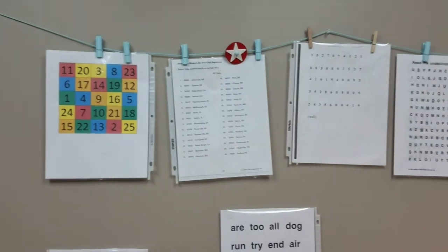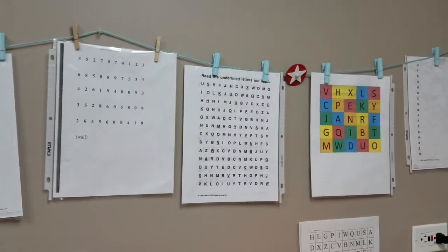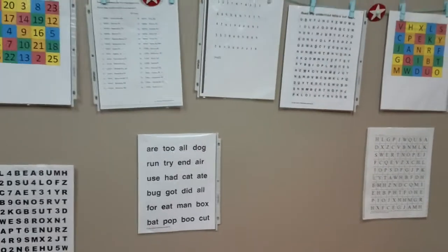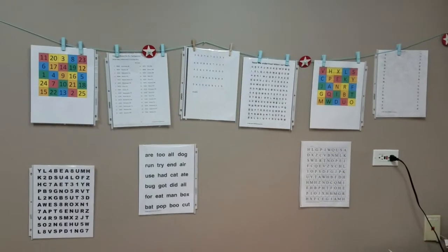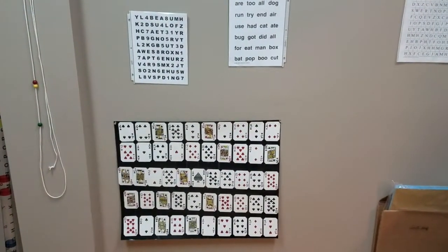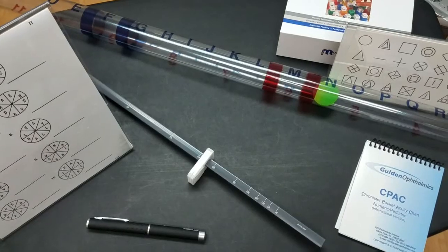It may contain such items as zip code lists, number charts, letter charts with underlined letters, small and short words, heart charts, and scanning boards like the one created here. Or it may just have something as simple as a pantry where you work on scanning and looking for items.